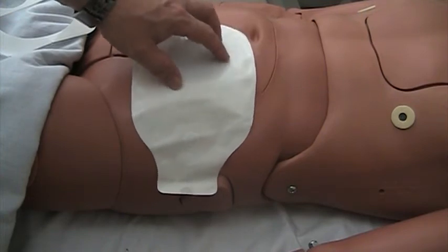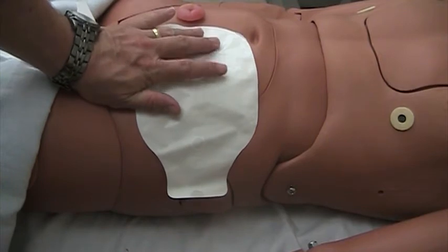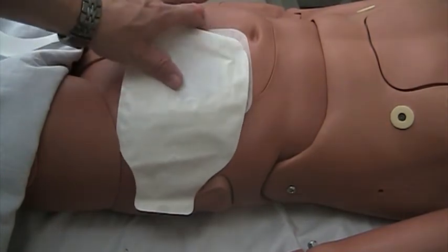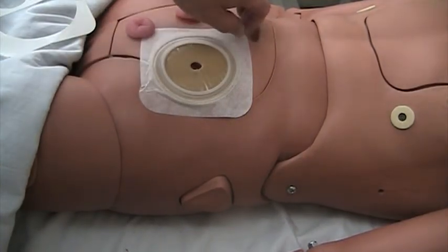Every so often you need to empty the bag, okay, if you're taking output. So over here it could look like a formed stool. If it was on the other side, it could be liquid, and you would have to measure. Okay, so that is how you put a wafer on a patient.